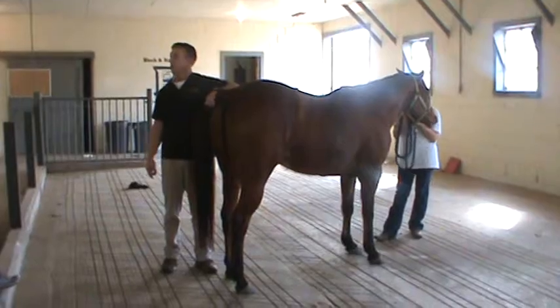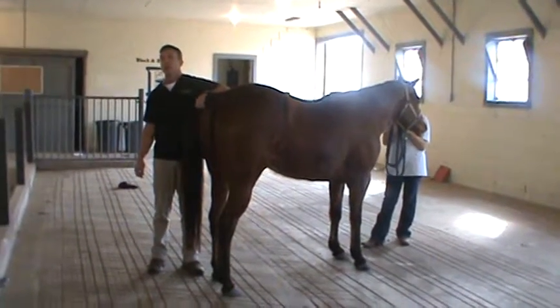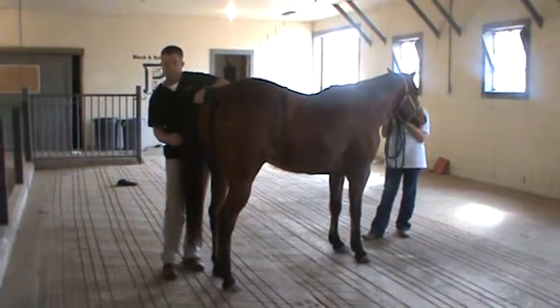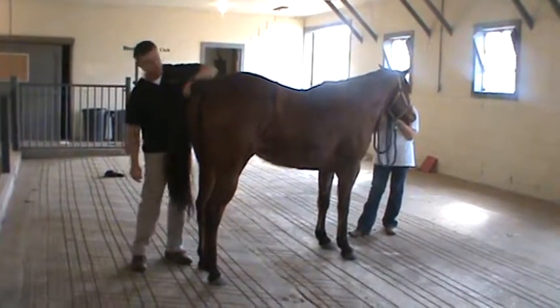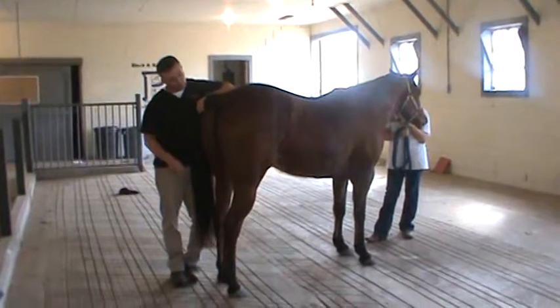Okay? Horses do carry a sexually transmitted disease called contagious equine metritis, and it's going to be infected in the clitoral fossa if they particularly have that. So that's just another thing that we look at. Okay? So this mare is good. Her conformation is fine. We would not do anything to this mare.